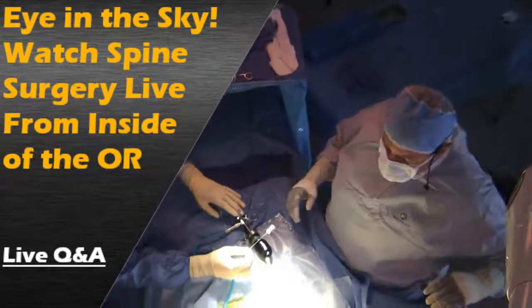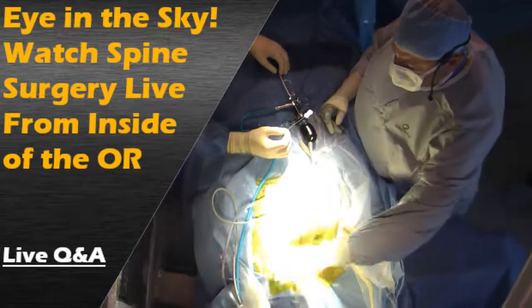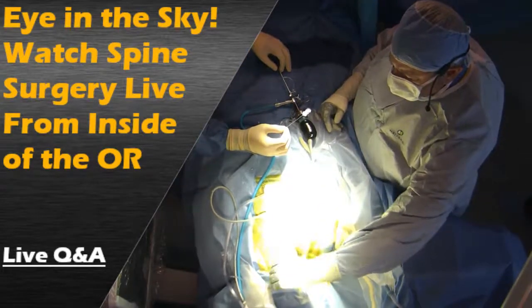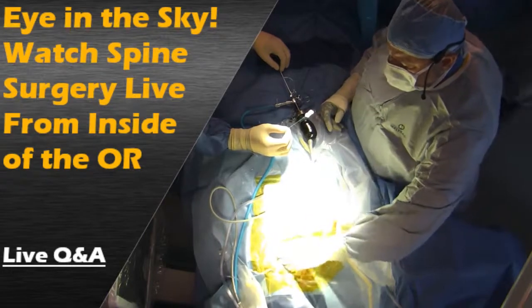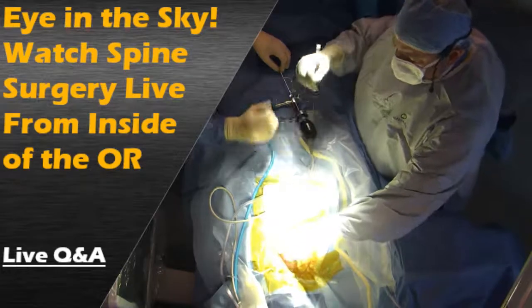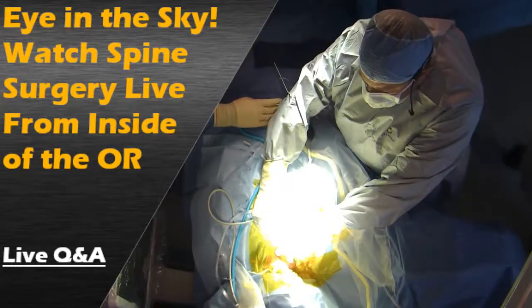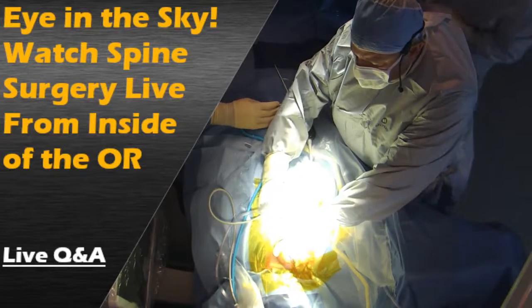So she had the opportunity to have a fusion done, an anterior cervical discectomy and fusion. She didn't want to do that. She wanted to try the laser surgery. The laser surgery we do is done without fusion. It's done anteriorly, and it's not just a discectomy, but an annular debridement.